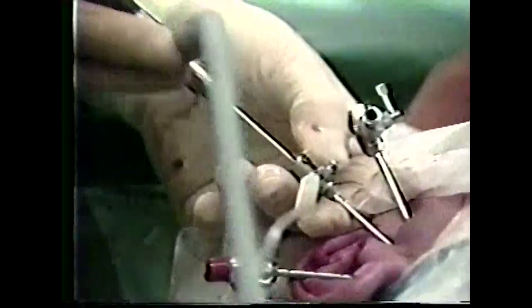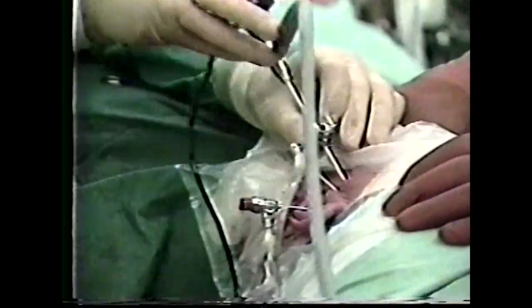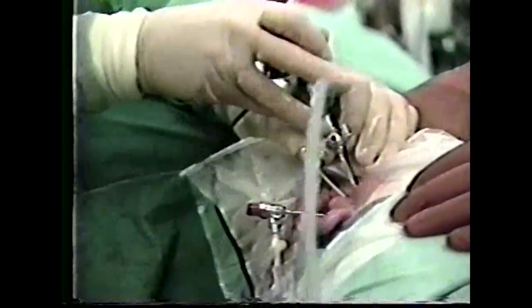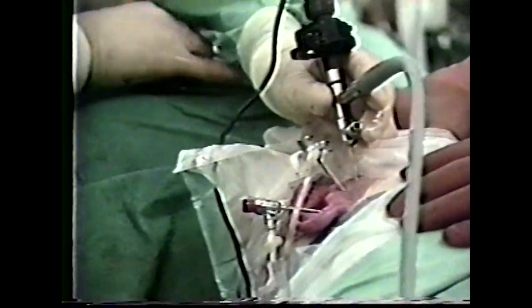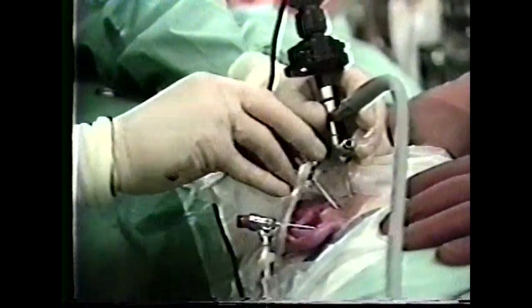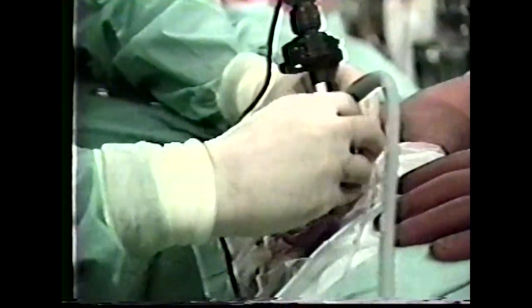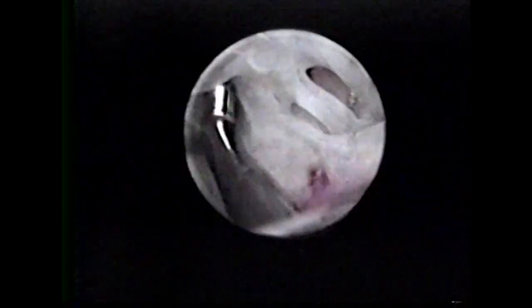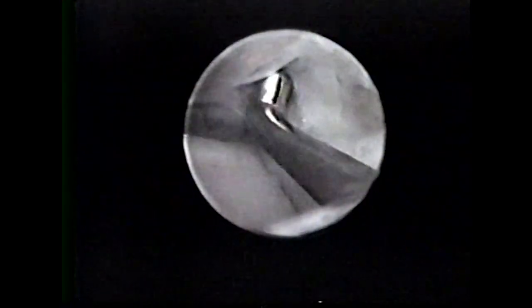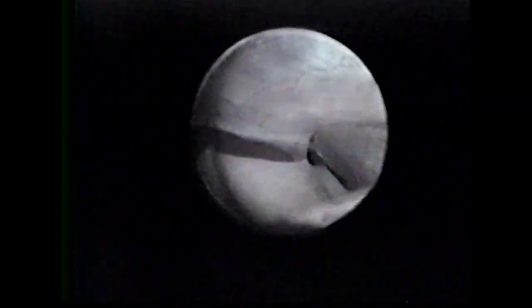With the arthroscope moved to the anterior lateral portal, instruments can be inserted through the infralateral cannula. In this case, a blunt, hooked probe is used to test the tenacity of broad adhesive bands in this severely restricted superior joint compartment.